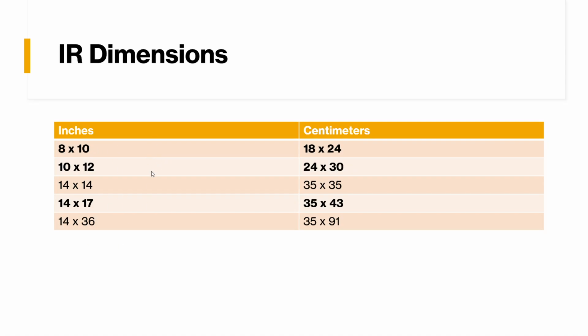So if you have a smaller body part, you might want to use a smaller cassette. In reality, in those types of things, they would use less film and be less expensive to hospitals. It doesn't really matter as far as exposure is concerned, because as long as you collimate well, kind of crop in that light, we're exposing your patient to less of that X-ray radiation.